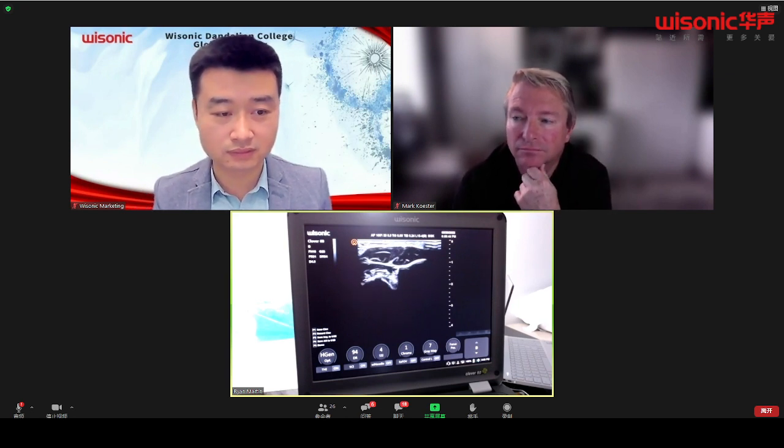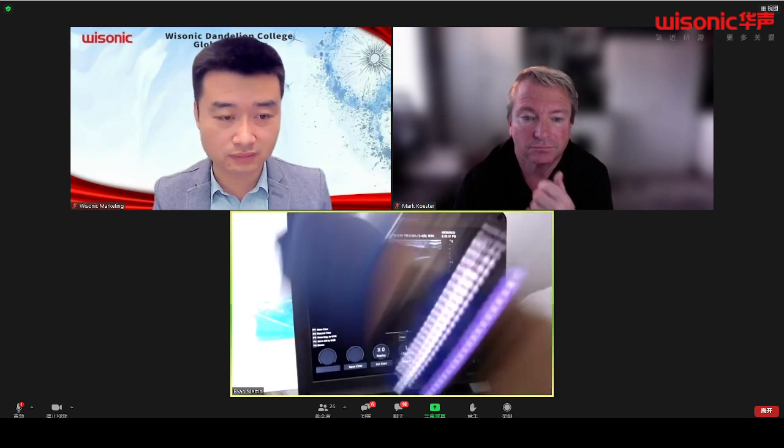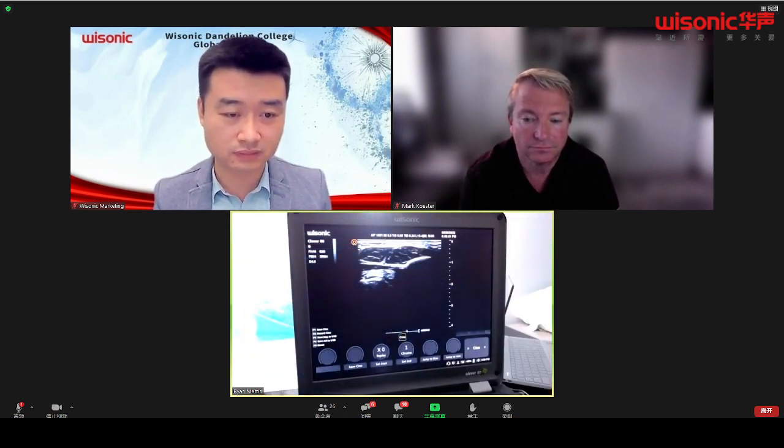Right in there. And so again, this could be a nice window of opportunity for injections right on that little space right there. So again, from here, you would come from this angle and come down into that tendon.